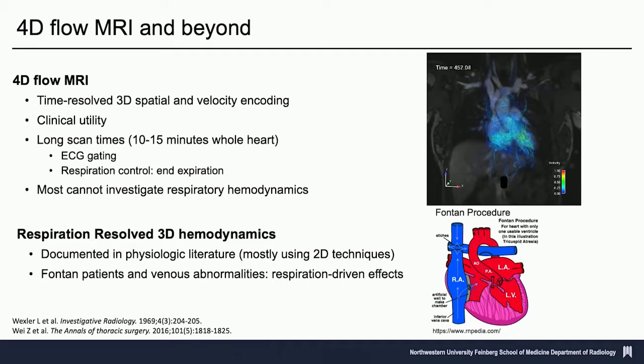However, we think that respiration-resolved 3D hemodynamics may be of interest because their effects have been documented in physiologic literature, and also their effects have been documented in Fontan patients and congenital heart disease patients with these abnormalities. They've been shown to have higher respiration-driven effects on cardiovascular flow.